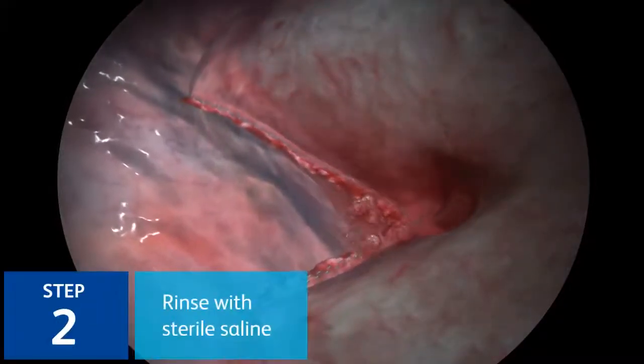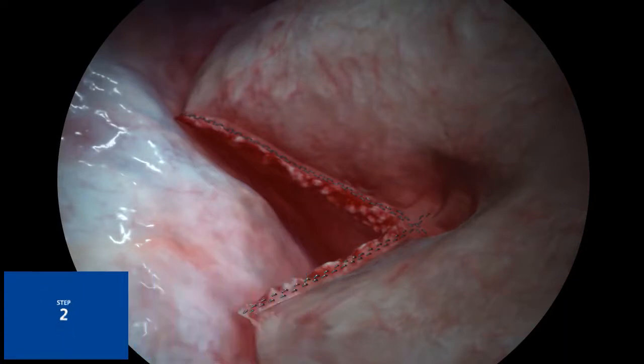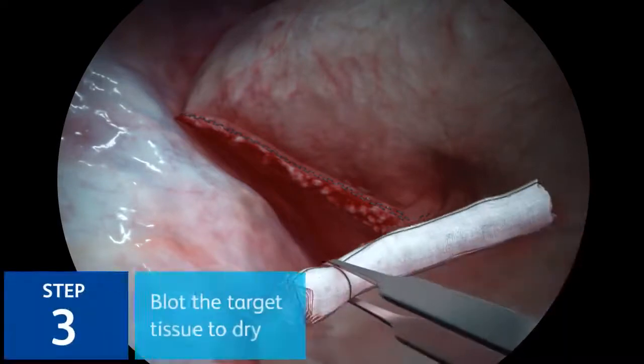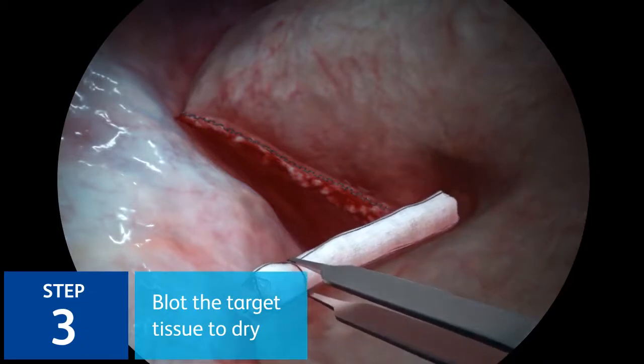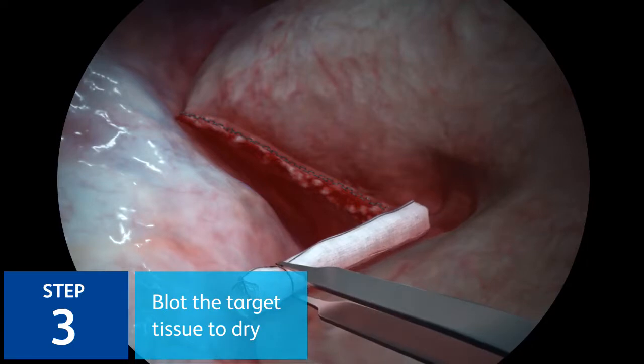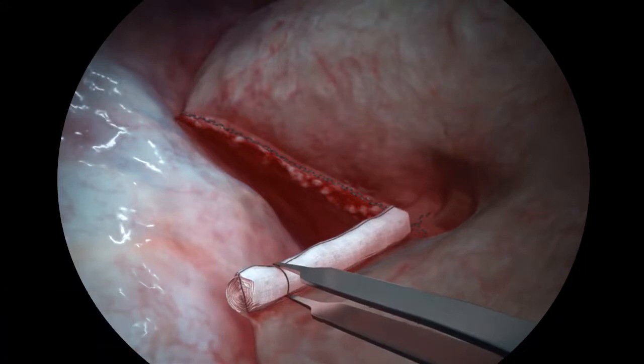Step 2. Rinse the visceral pleural surface to be treated with sterile saline to remove any pooled blood or blood clots with irrigation and/or suction. Step 3. Blot the target tissue area with a sponge or gauze to remove any excess moisture. For best results, Progel Pleural Air Leak Sealant should be applied to a clean, dry surface.